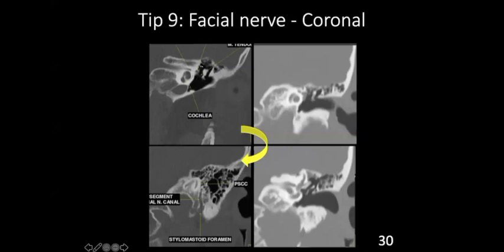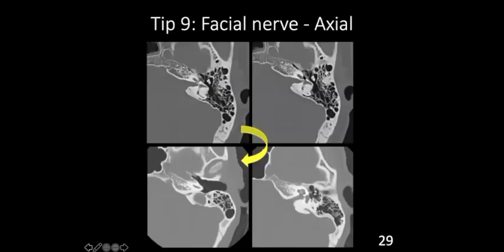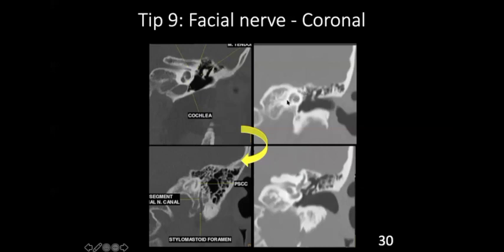In a coronal section, look for the falciform crest in the internal auditory meatus — it runs from the fundus backwards and divides the meatus into superior and inferior parts. You can see the labyrinthine part of the facial nerve running in the meatus, usually superior and anterior to the cochlea. You can see the cochlea's two turns here, and the labyrinthine part of the facial nerve. The first genu of the facial nerve is anteriorly and superiorly located relative to the cochlea — remember it runs anteriorly then comes backwards from the geniculate ganglion.